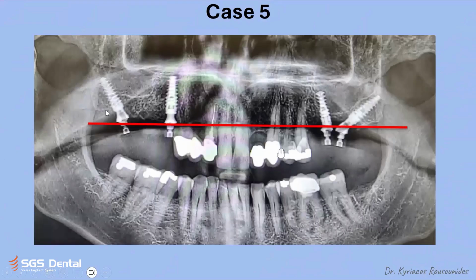You can see here also the level that we reach. Here, maybe we need to change this abutment again to a 45 degrees. And here I am trying to find maybe a better angulation. This is 45 degrees already.